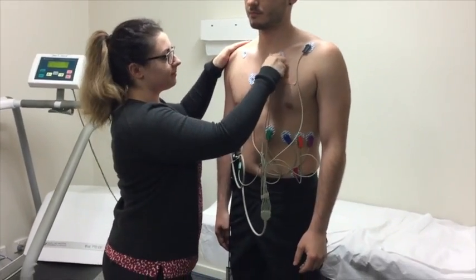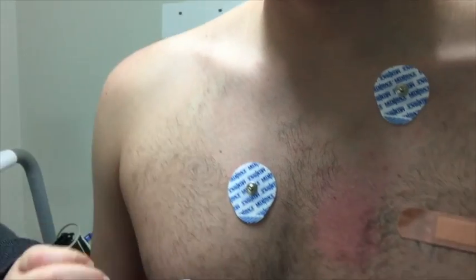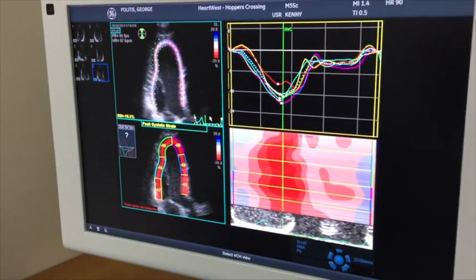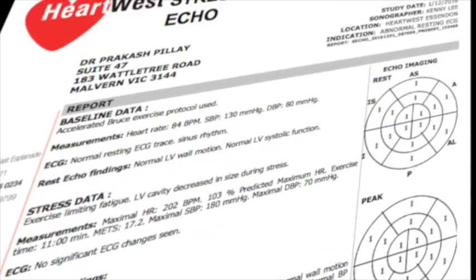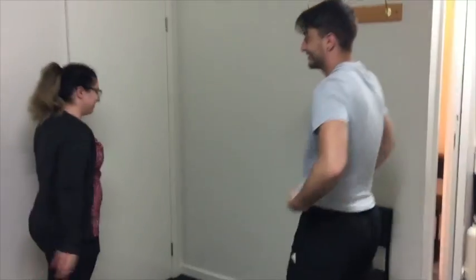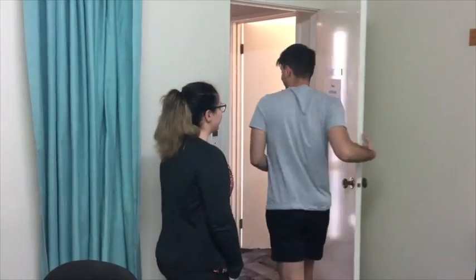When all images have been obtained, you will be asked to sit up. After a few minutes, the ECG leads will be disconnected and the ECG electrodes will be removed. A cardiologist will look at these images and write the final report, which will be sent to your referring doctor. Thank you for choosing Heart West.